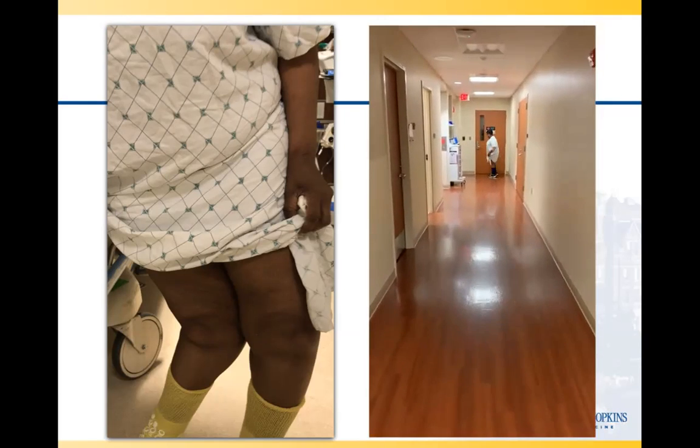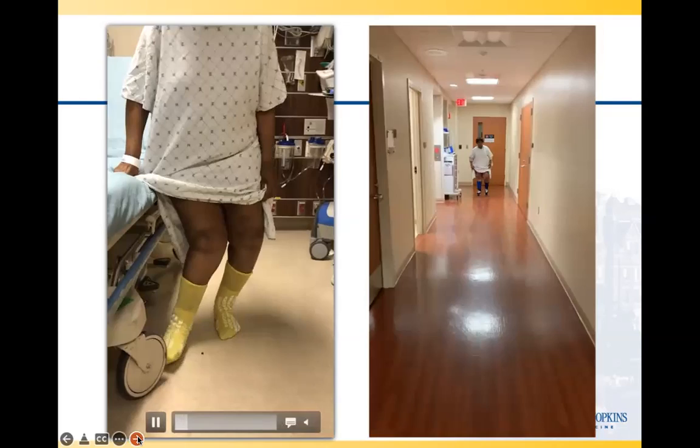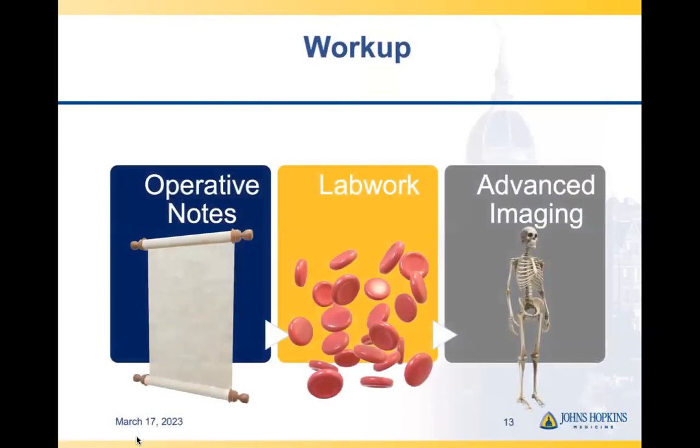So there are several factors that we have in addressing patients with failed implants. The first thing that we as surgeons look at when someone walks in with a painful implant, or an implant that makes a lot of clicking sounds or sounds that are similar to their arthritis sounds, which is a lot of grinding, or if we pick up images that indicate that the implant has failed, is the operative notes. The reason for doing that is because I want to find out what type of implant was used and what company makes the implant, because like every mechanical device, these implants come with very specific instrumentation on how they are placed and how they can be removed. So we need to understand that.